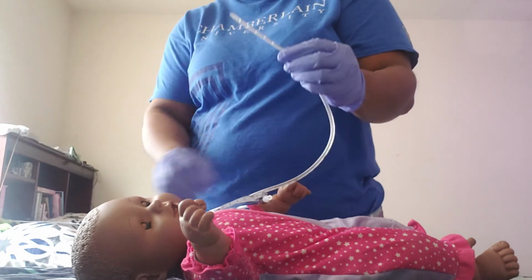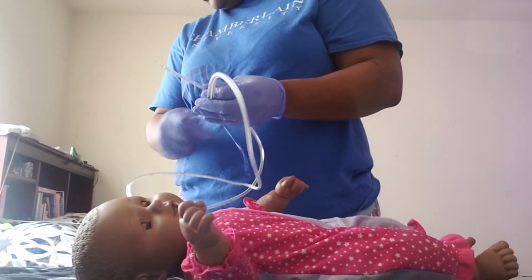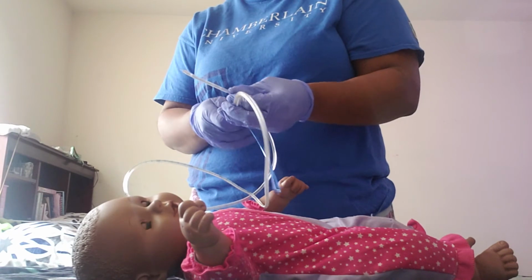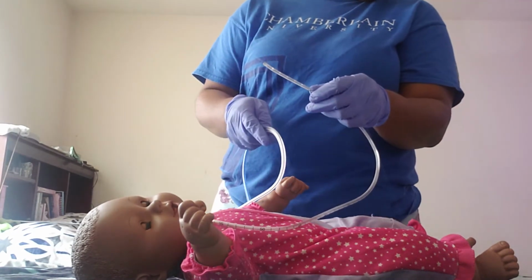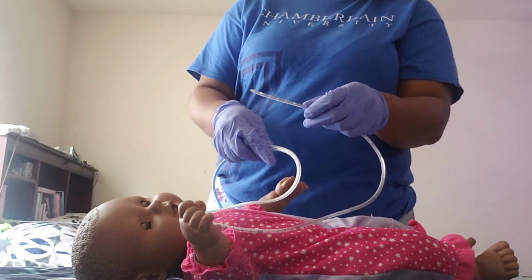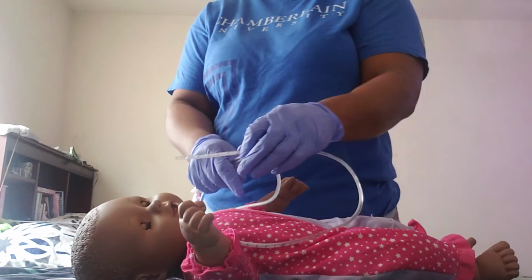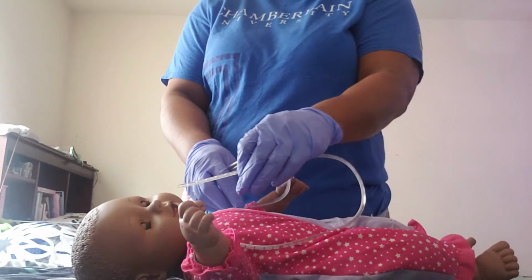60cc syringe and I will attach it here. So this will be my 60cc syringe. I will attach it there, and then I will go ahead and insert the tube slowly, aiming to the back of where the patient's ear is.